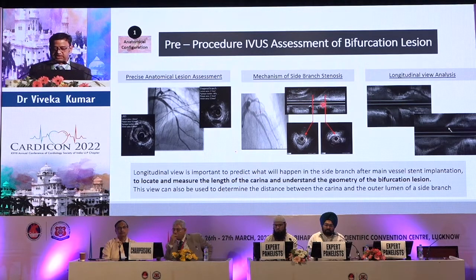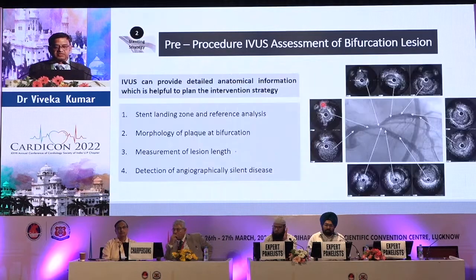Based on that, we can plan a strategy, and believe you me, all the two-stent techniques have come, but the best is still the single crossover stent technique. So we need to focus on that. The imaging gives us the stent landing zone and reference analysis. So we always go by the distal vessel reference diameter.